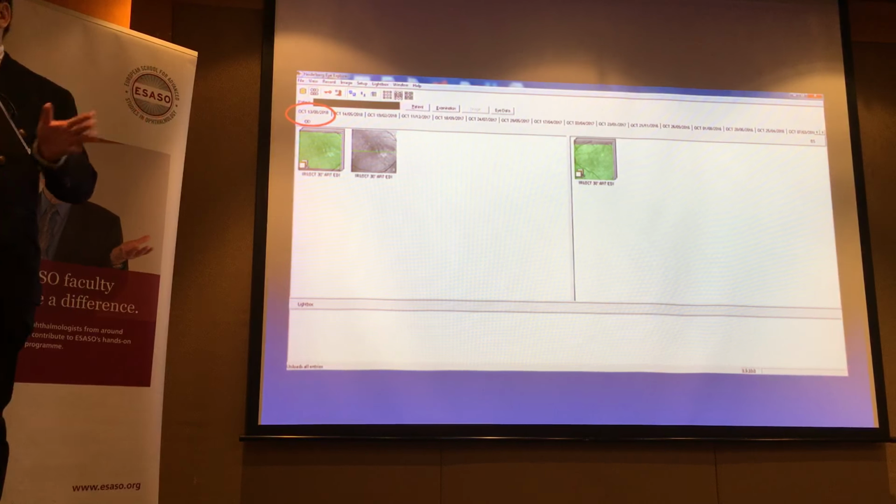But I treated her at this point, and at that point she was on monthly injections. I treated her because she had bad edema, okay, and it was worsening. So I gave her a jab and I said, I'll see you in 1 month and I'll review. So she came in 1 month later, right, and it always feels just like yesterday, like, weren't you just here last week or something? But she came in again and it was 1 month.